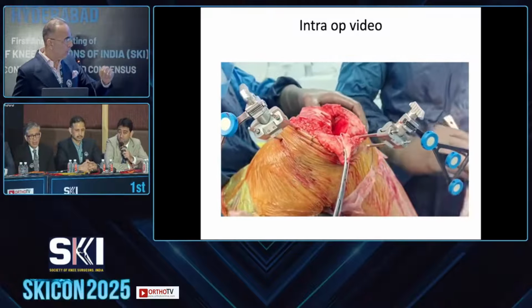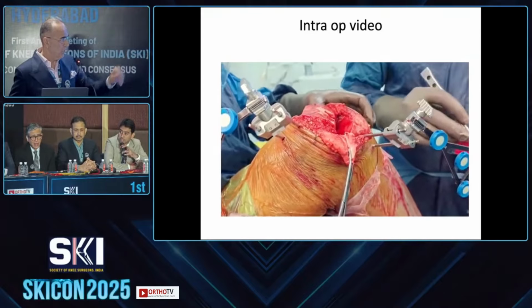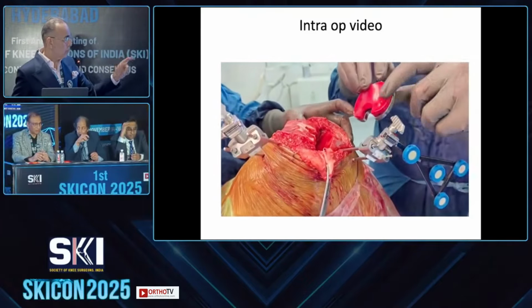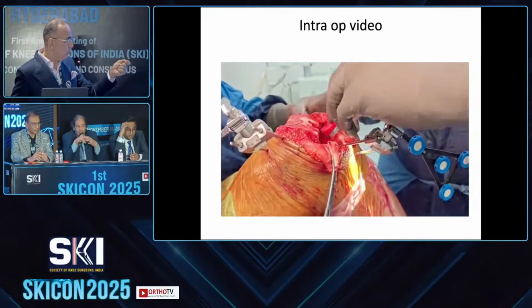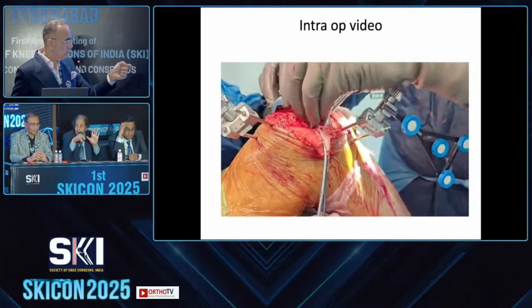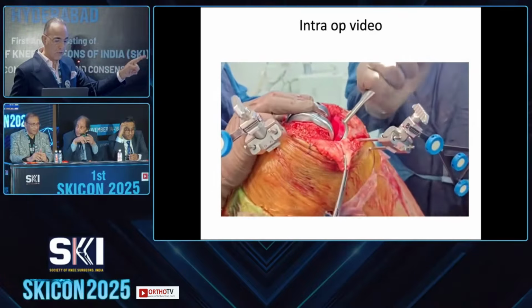I would accept it, but Dr. Rajgopal, would you accept that much play that I just showed? Because the CR is intact, right? Yeah, PCL is intact. No, I would not. You would not? No. So what would you accept? It's absolutely rigid. I need a snug medial, 1 millimeter at best, 2 to 3 millimeters at that range of flexion. Yeah, so this is acceptable.